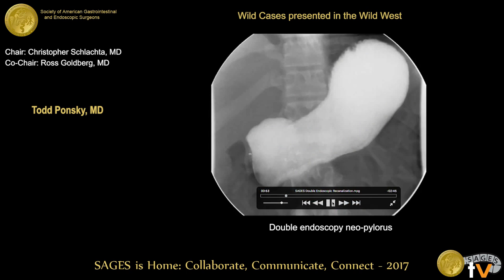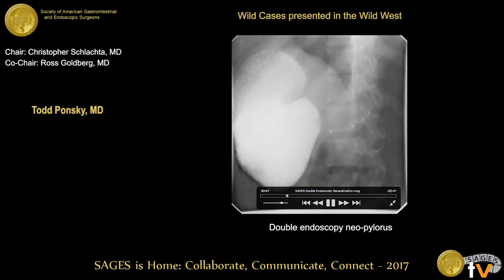However, 5 months after surgery, the pylorus still failed to reopen as expected, as seen on this upper GI. Damn it. So 5 months later, it's still closed. Who would keep going, keep waiting? Who would intervene? It's 5 months out, his pyloric exclusion still hasn't opened. They're supposed to open. So I'm sorry, who would intervene? Okay. Who would wait a few more months?